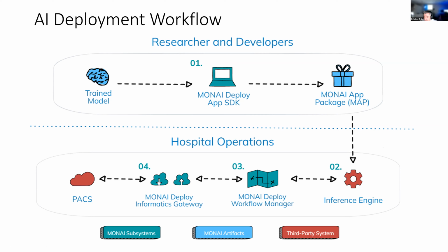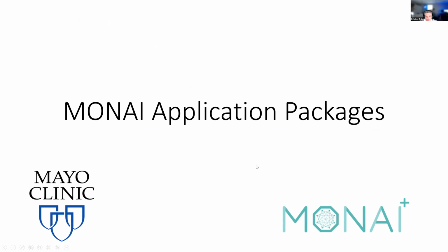That can be your Kubernetes setting or whatever you have. You can run simple packages themselves, simple Pythonic code, or a container or Kubernetes type of environment. Then execute that and integrate it into your workflow and pass the information along to systems like PACS and so forth.